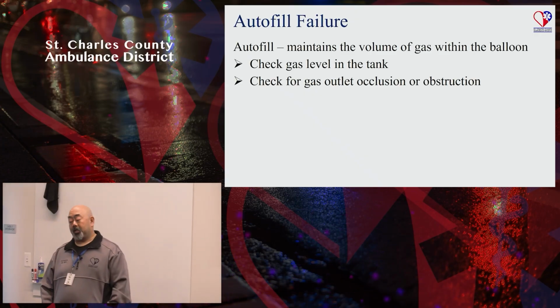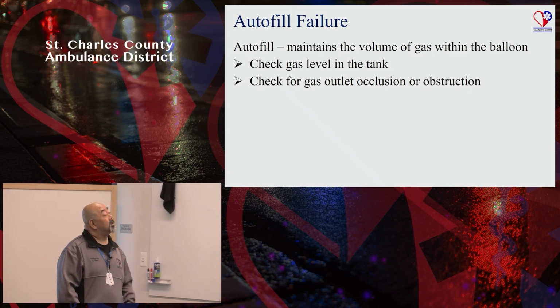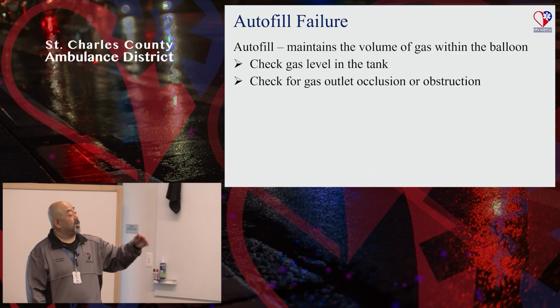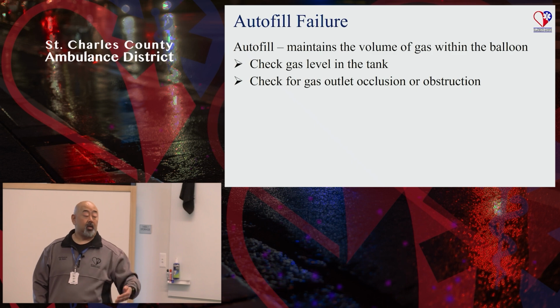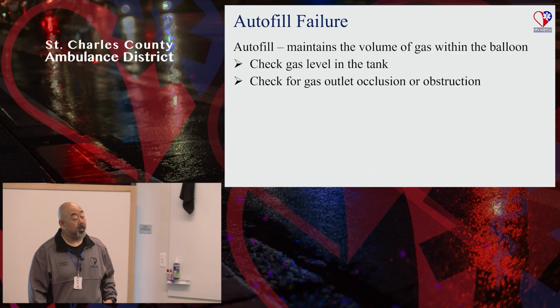So the other one is the autofill feature, and what this refers to is what keeps the gas. It maintains the volume of gas within the balloon. So check the gas level of the tank, and make sure there's no gas outlet, occlusion, or obstruction. Again, fundamentals, easy fixes, easy things to do to see if that fixed the alarm, and go from there.